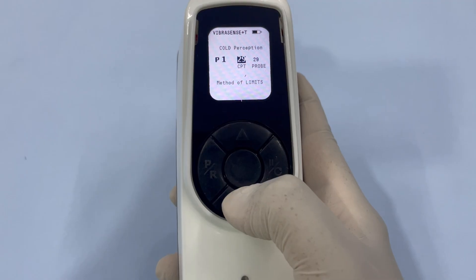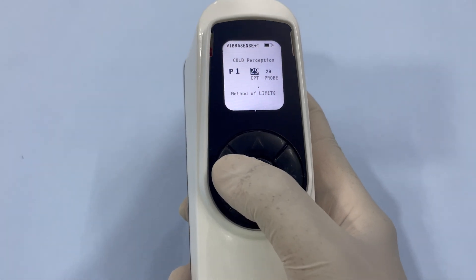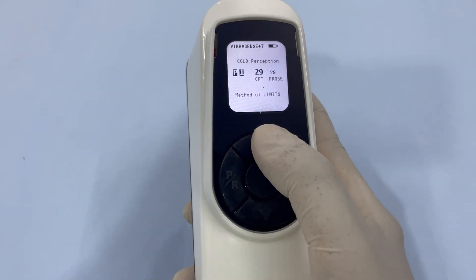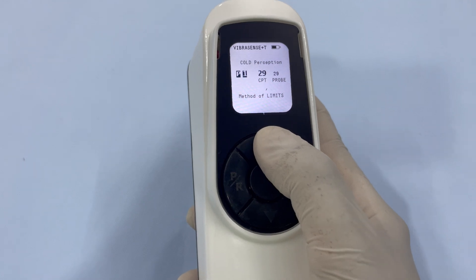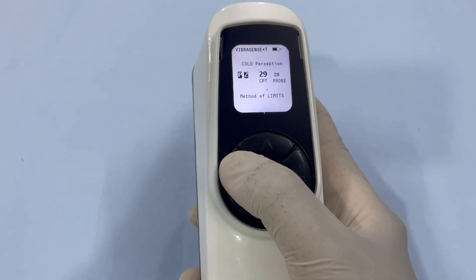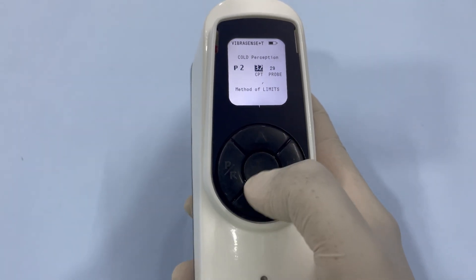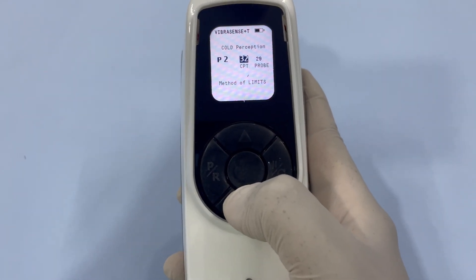After testing at P1, press the PR button to save the recorded data and bring up position 1 on the screen. Next, use the up arrow to select the next position P2. Press PR again to lock in this position for testing.